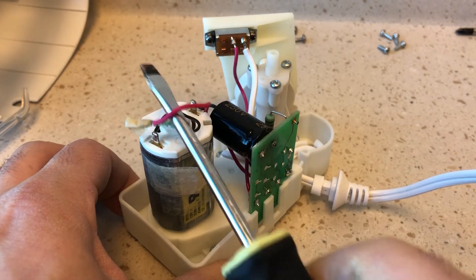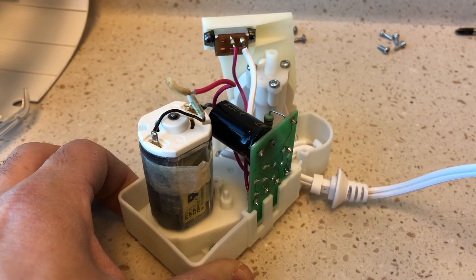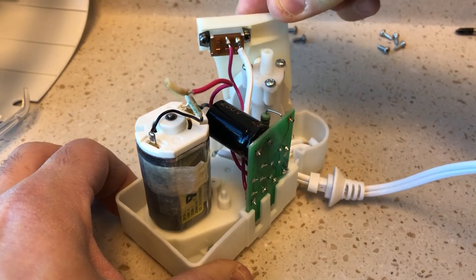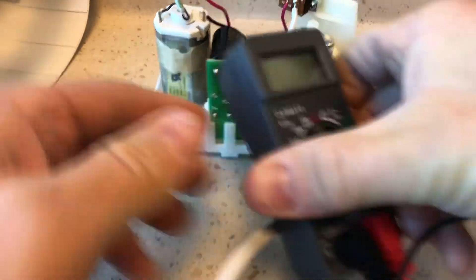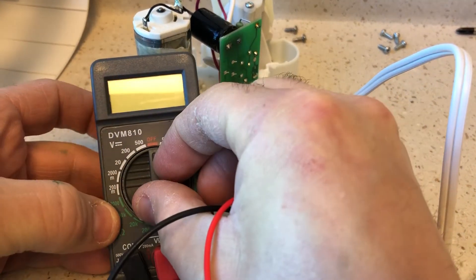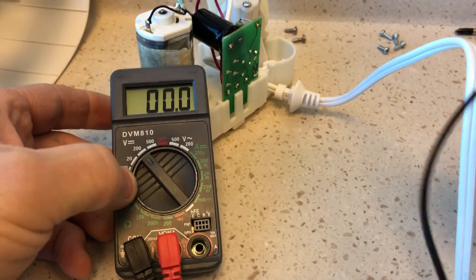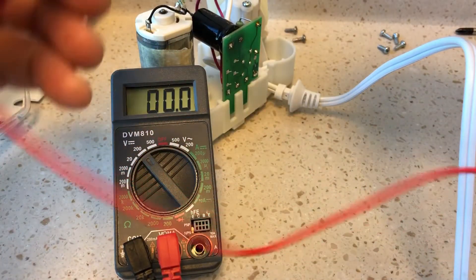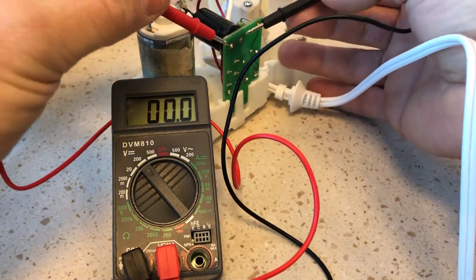Nothing — okay, dead. Just to show you again the amount of voltage on this cap: I had this thing unplugged the whole night, and yet even after all that time I came back in the morning and it still had a charge. Let me just show you what we're dealing with here on this cap — it's dropping now, but even dropping it's still quite high.